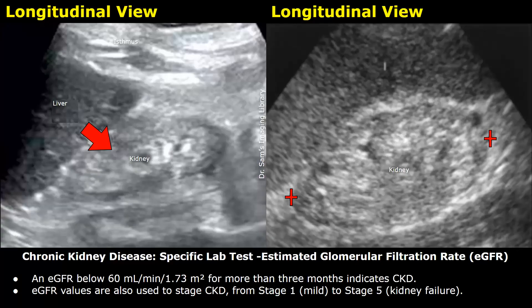Chronic kidney disease is diagnosed when the estimated glomerular filtration rate (eGFR) is below 60 ml per minute per 1.73 meter squared for more than three months. The eGFR values are also used in the staging of chronic kidney disease, from stage 1 (mild) to stage 5, which is kidney failure.